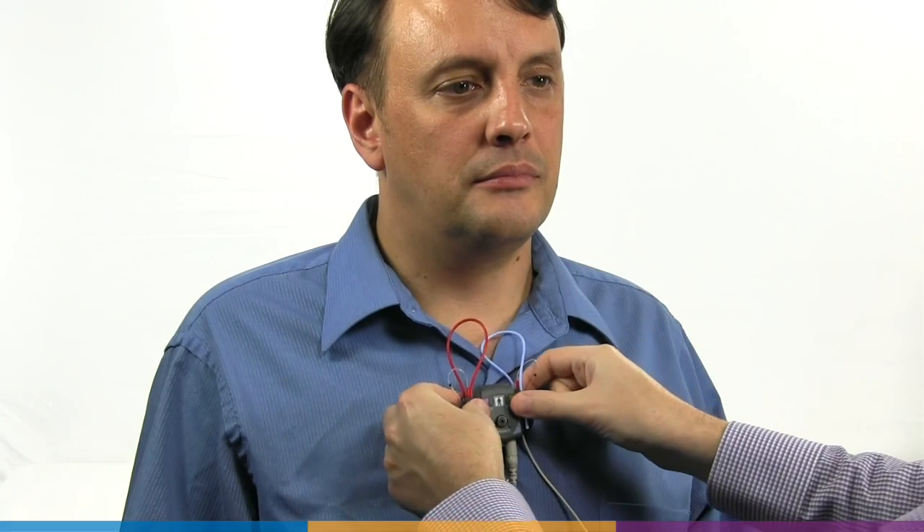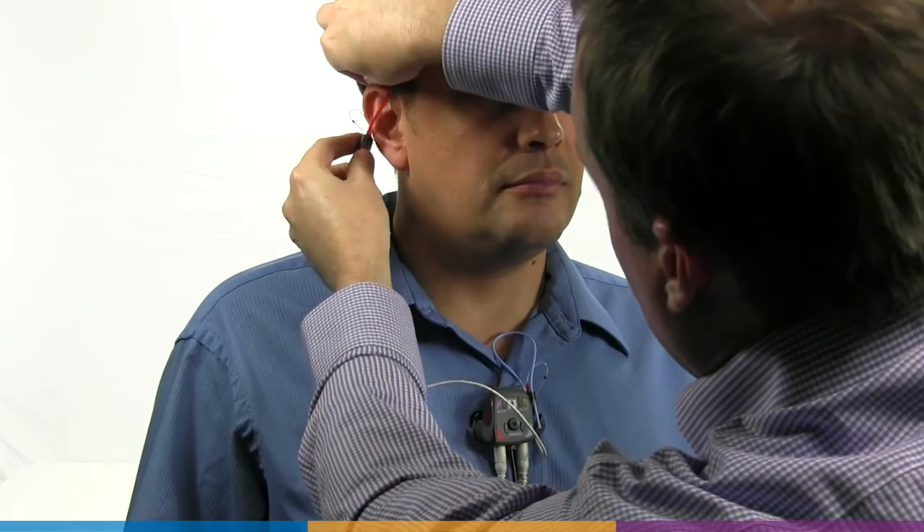For Verifit 2, clip the probe dock to the client's clothing near the middle or to one side. If it is more convenient, it can alternatively be clipped to a lanyard or to the chair back. It needs to be positioned so that the probe microphones will easily reach the subject's ears.